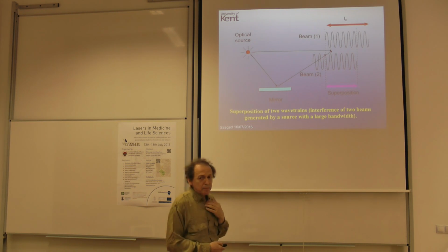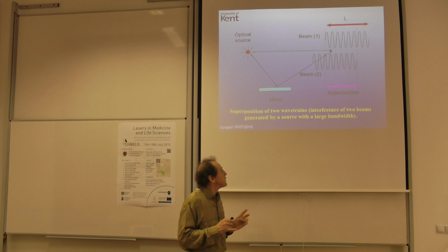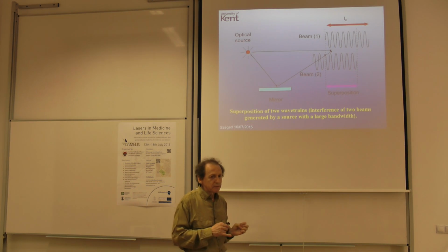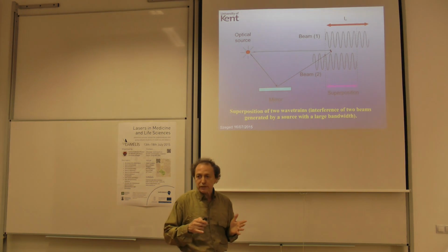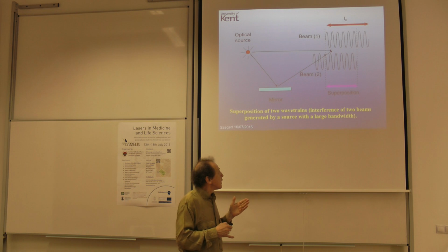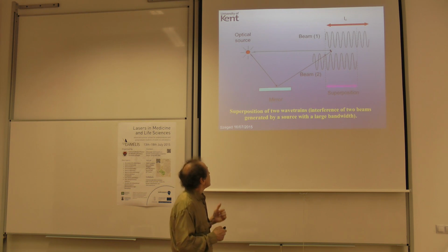This is also a basic representation of showing the limits of the technology. Now, I'm going to tell you that there are two main types of technology: time domain and spectral domain. Practically, the OCT started as a time domain. But by 2000, 2002, the emphasis shifted from time domain to spectral domain. And I would be very happy if you went out from these lectures with this idea, why the technology migrated from this type to the other types. And it's not only that, what are the values of each technology, and what are the applications of each technology. And I'll go back to that.